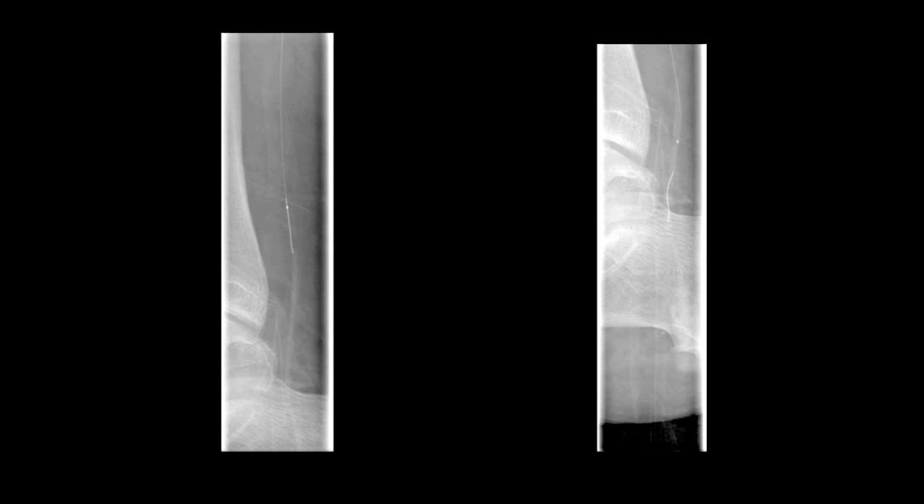So let's let this wire dance its way down and hopefully give us a good result. Now that's what I call wire salsa. As you can see, we were able to acquire a posterior tibial with inline flow all the way down to the foot.